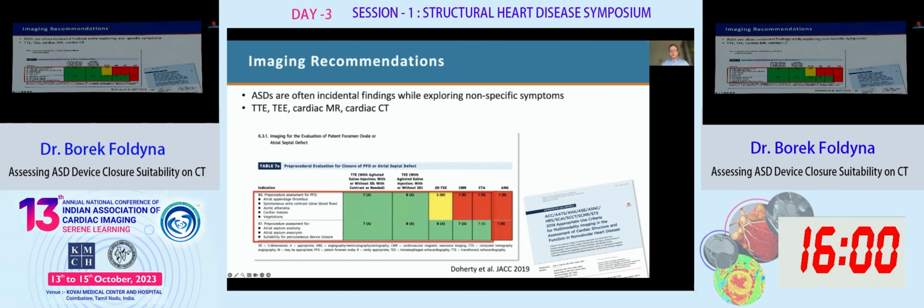The relatively recent ACC guidelines from 2019 show us the current recommendations. In general, if you are looking for relatively large structures like atrial appendage thrombus, spontaneous echo contrast, or aortic atheroma, cardiac masses, or vegetations, the guidelines recommend a TTE or 2D TEE. If you go a little bit more into the nitty-gritty and look for details, for example, anatomy assessment for planning for percutaneous device closure, the guidelines recommend 3D imaging, in particular, including echocardiography, so 3D echocardiography, but also MRI and CT.